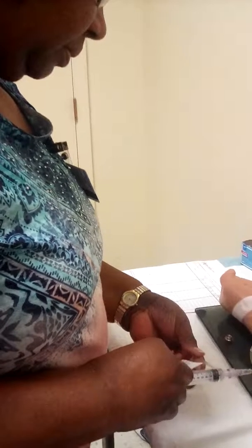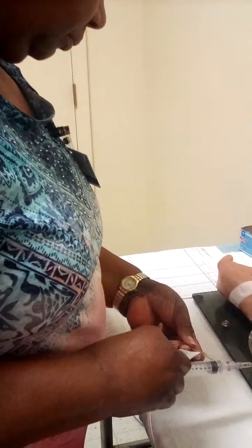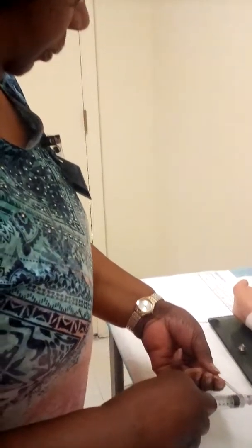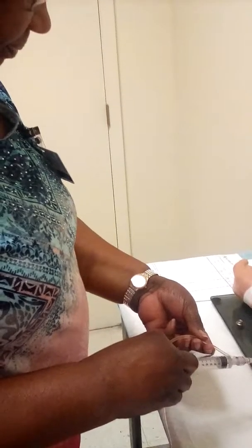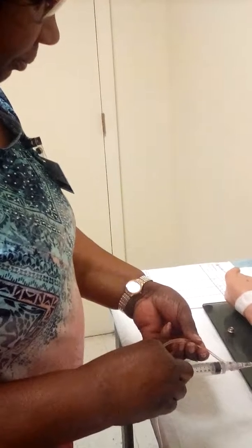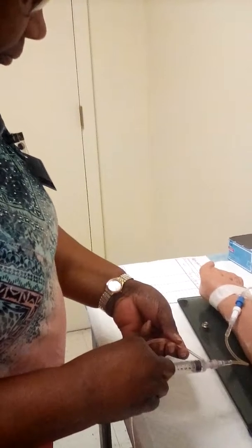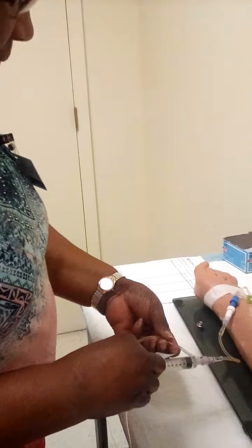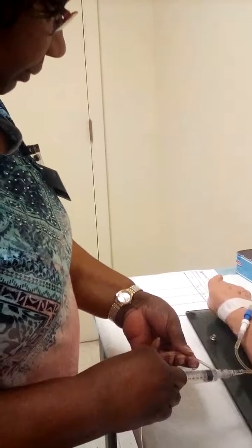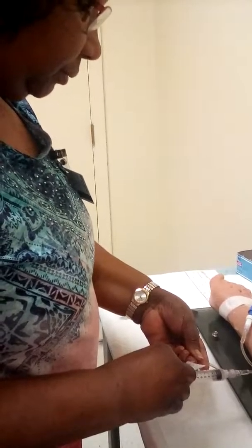Okay, I'm gonna push and pause. Checking on my patient, make sure the patient is doing okay while I'm giving my medication. Push, pause.